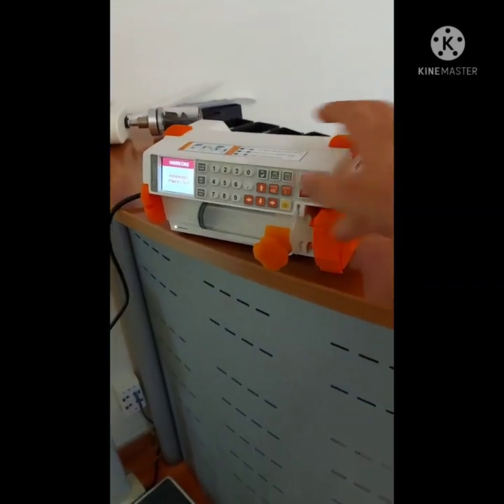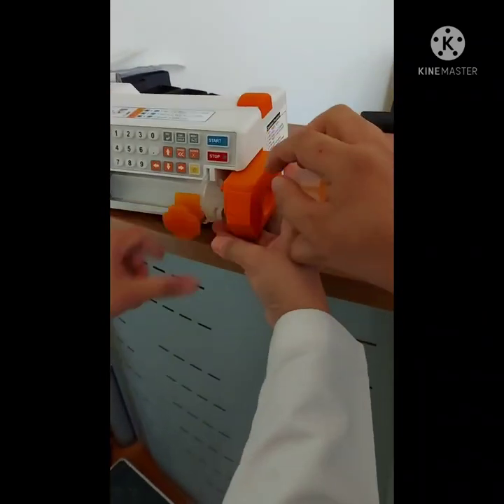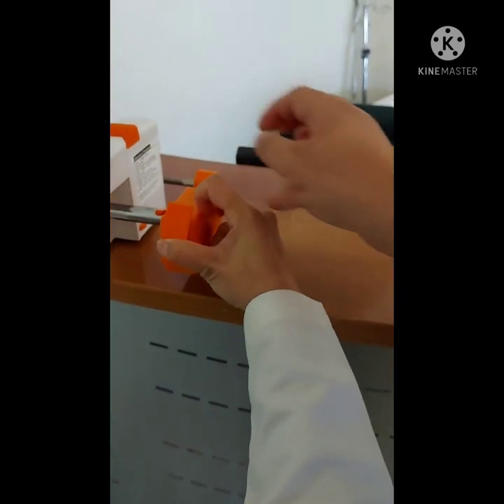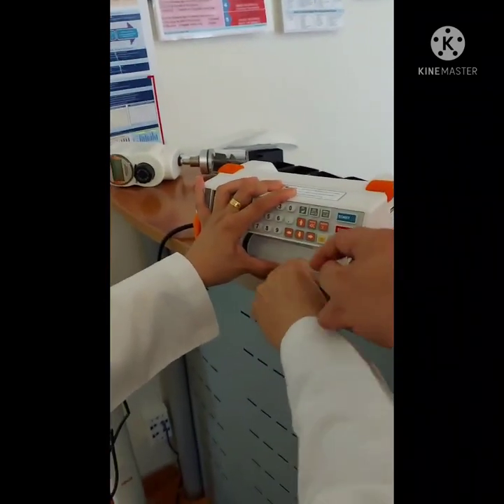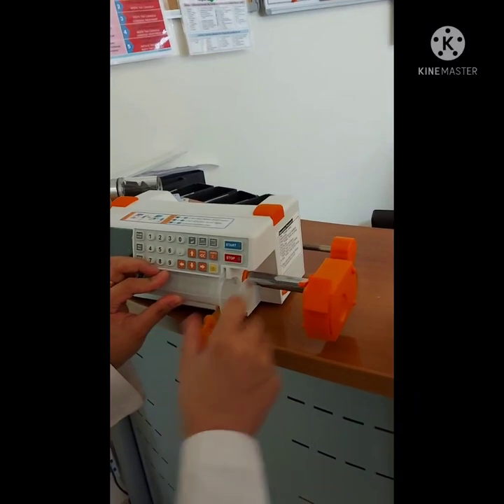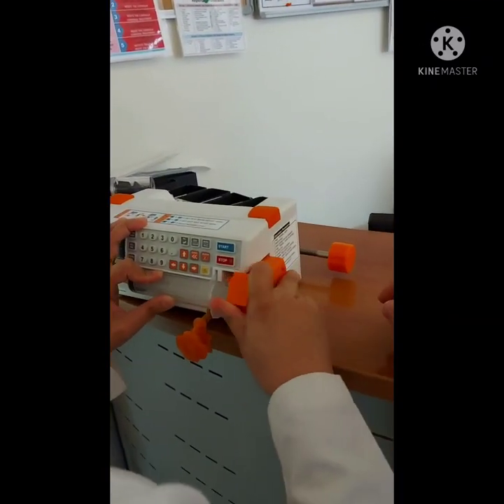Because you should cancel the running first and then. Wait. Open first. And the ball? It's soft. Then this one? Yes, this one. I prefer to run the machine and then install the syringe in the pump.